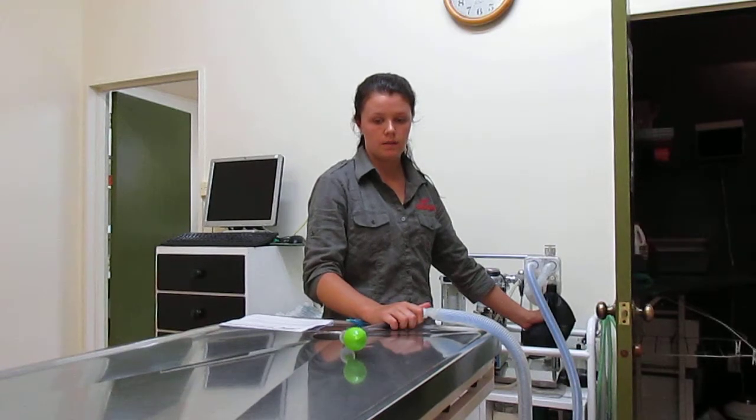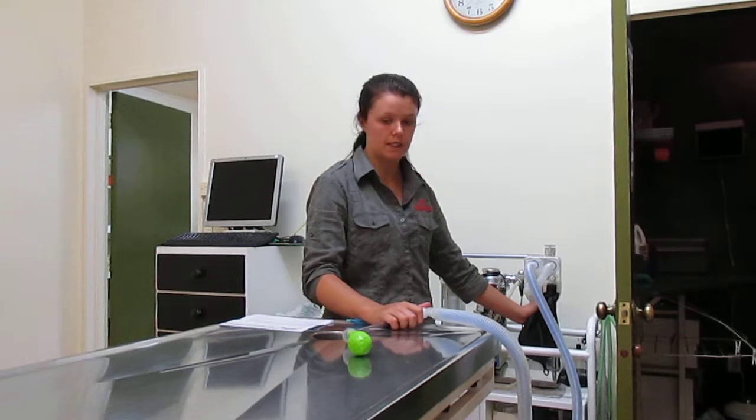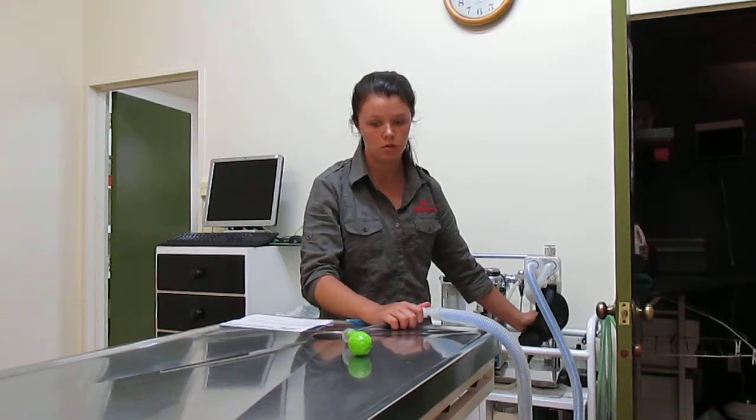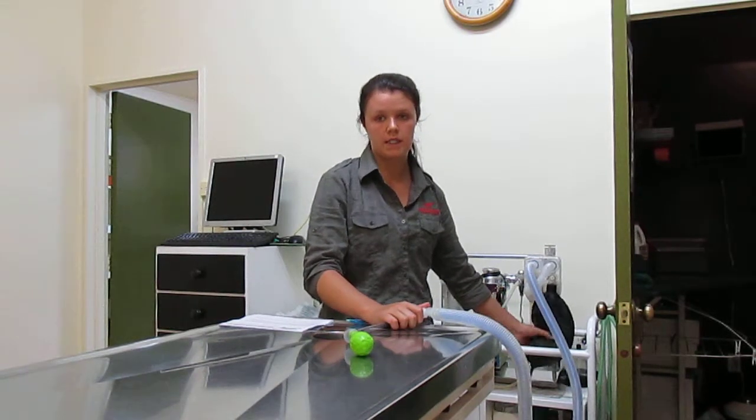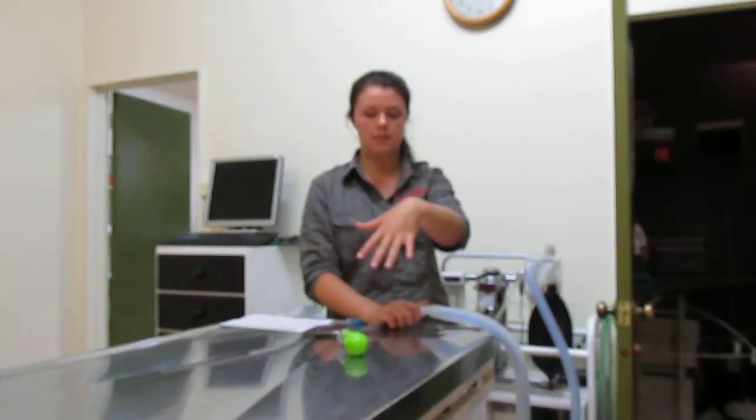Let the animal breathe out, then give it another breath. The amount you squeeze all depends on the animal itself — never squeeze too much. You can see the chest rise when you squeeze, and you can see the lungs inflate and deflate. So you kind of have an idea of how much to give.